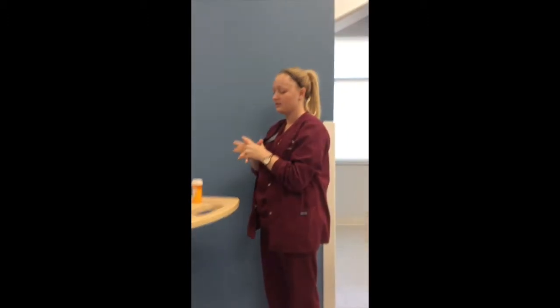Okay, so today I'm going to be demonstrating how to give a medication through an enteral tube, feeding tube, or a nasogastric tube. So the first thing I'm going to do is go to the computer, pull up the patient's MAR, and pull up their doctor's orders for the medication. I'm going to compare the two, make sure that they're congruent, make sure that it makes sense, of course, and then I'm going to look and see what medication is ordered at this time.